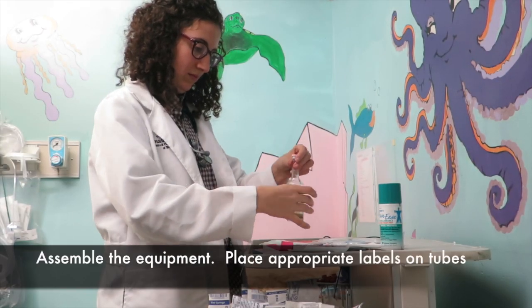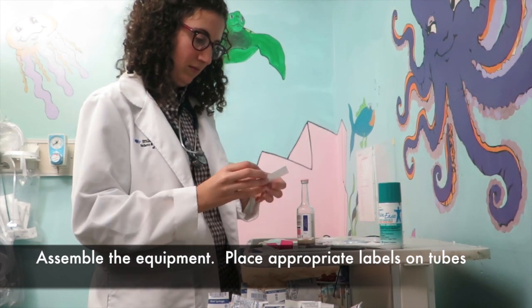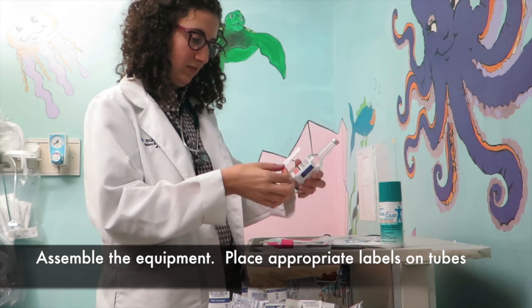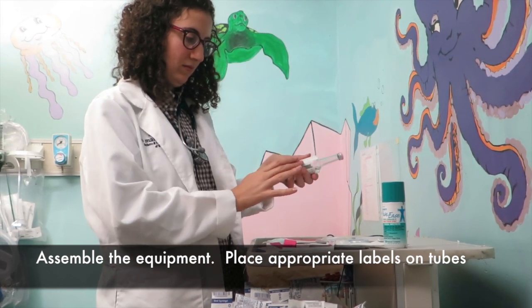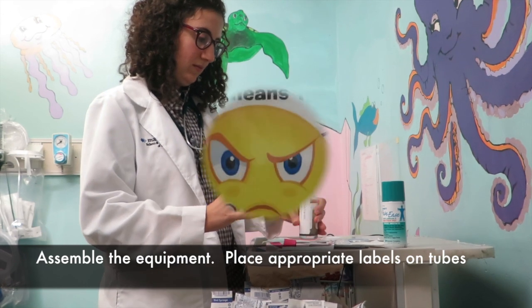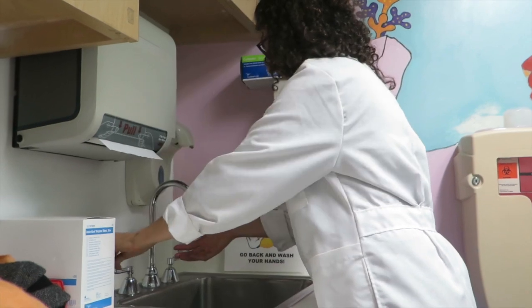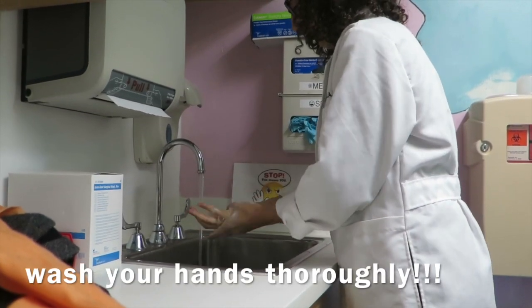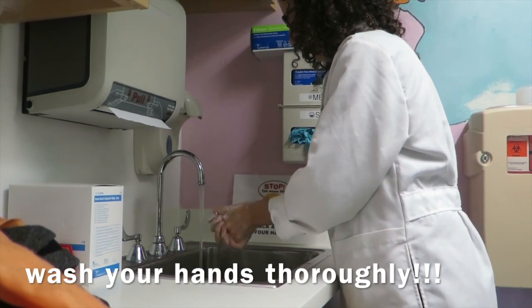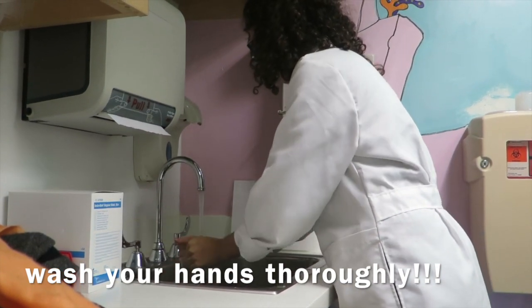Assemble the equipment and place appropriate labels on the tubes. The most important step in preventing contamination and infection, as we all know, is thoroughly washing your hands.